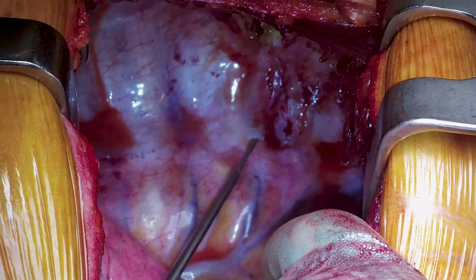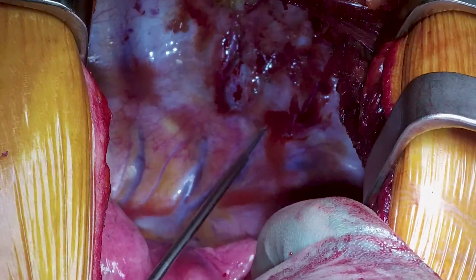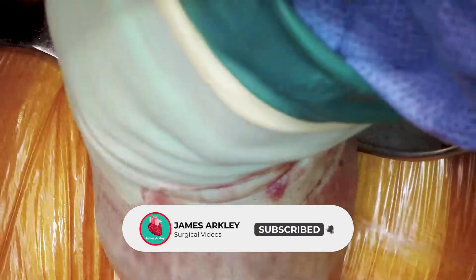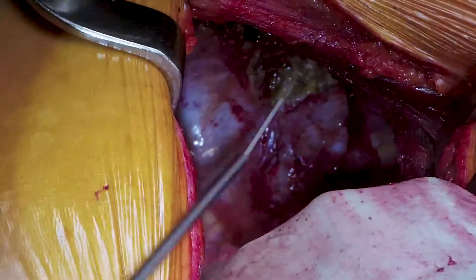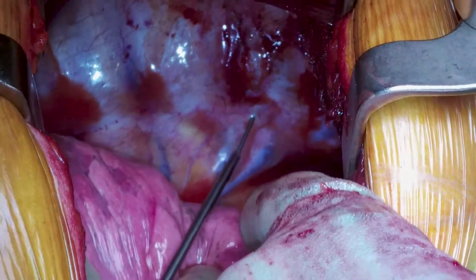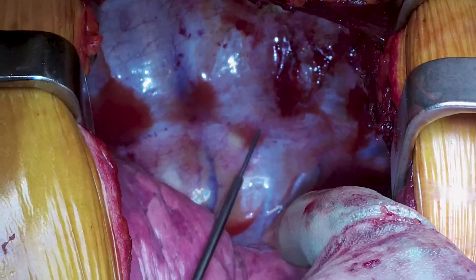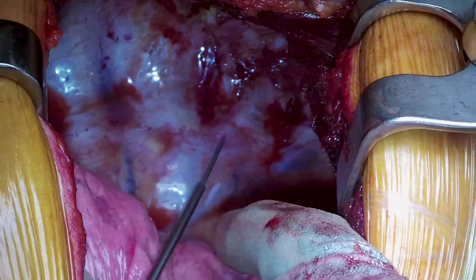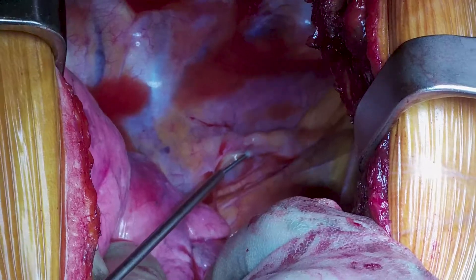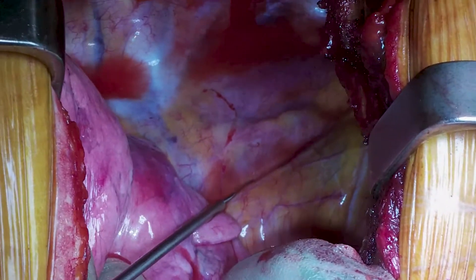Now the tumour is down off the chest wall, we can finish off with the intercostal blocks. Doing this proximally is best, and you can include the sympathetic chain — you can actually see the vertebral bodies to help guide where you're injecting. Injecting at station R2-R4 for the area of the vagus nerve helps numb the mediastinum. The final injection site is the sub-carinal station, giving maximum pain relief for post-operative pain, as thoracotomies can be very sore to wake up from.